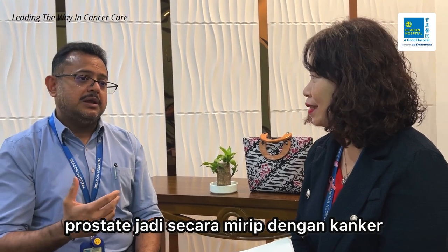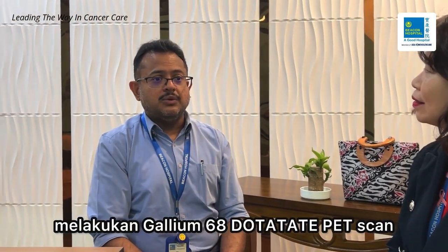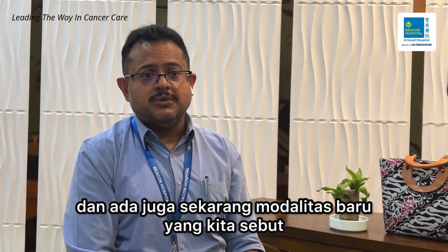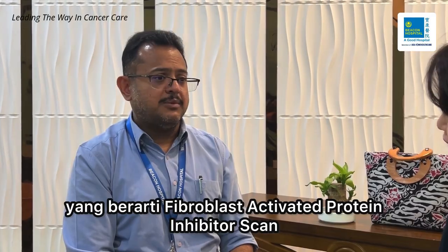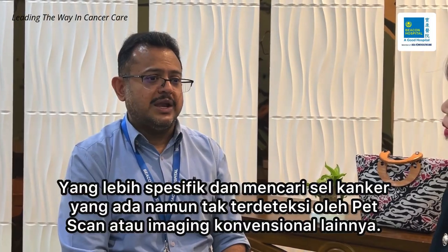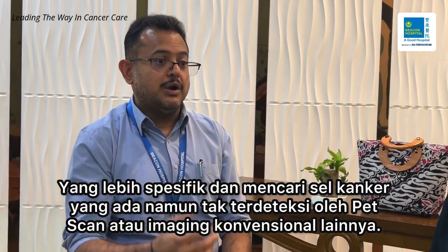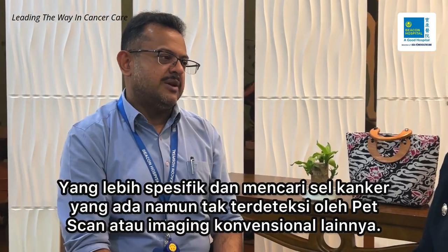Similarly, in other cancers like neuroendocrine tumor, you need to do a Gallium-68 Dotatate PET scan. And there is also now a new modality which we call Gallium-68 FAPI, which stands for Fibroblast Activation Protein Inhibitor scan, which is more specific, and it looks for any cancer cells which are present, which were not detected on FDG PET scan or other conventional imaging.